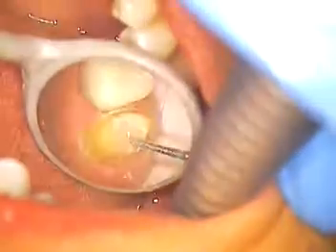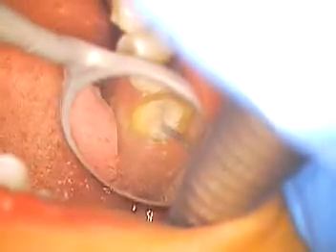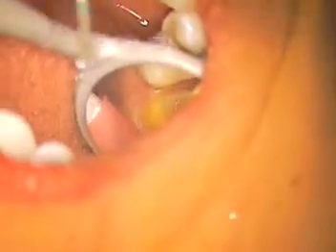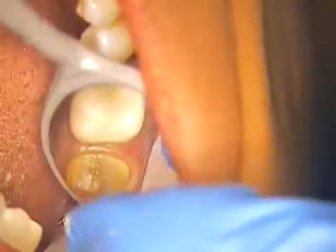Always check visually. Now the distal could be adjusted a little bit to give an even thickness, so I'll do that. And go on the distal and adjust distal plane, need suctioning, air in the mirror. Close again, all the way down, and check that distal again. That looks nicer. Open again.